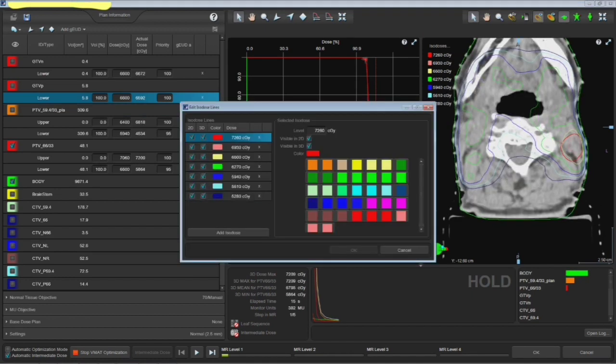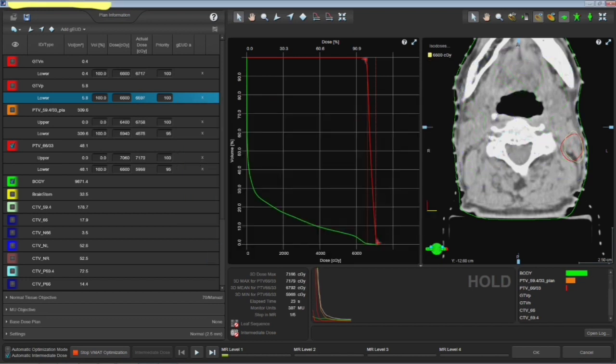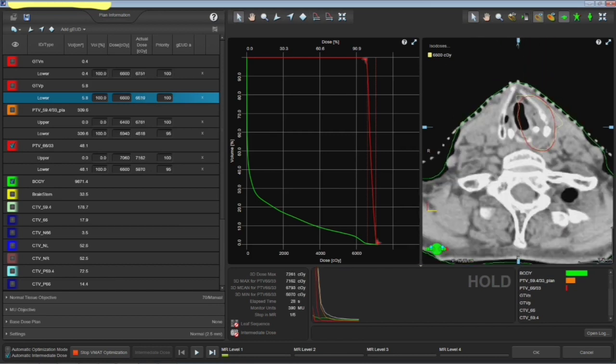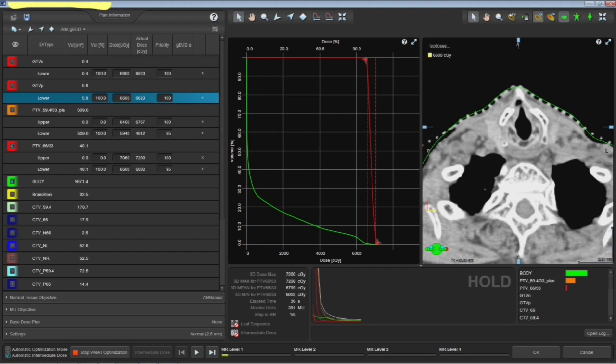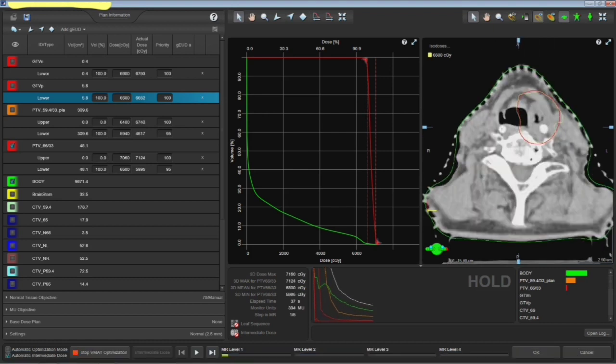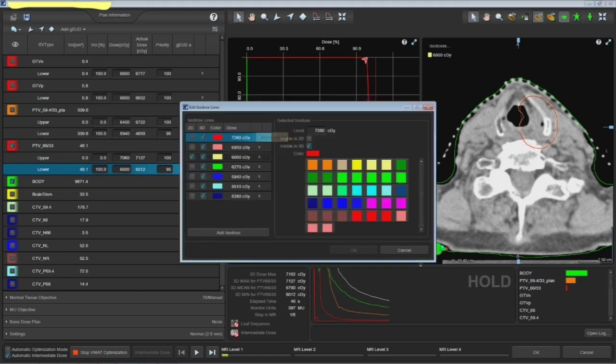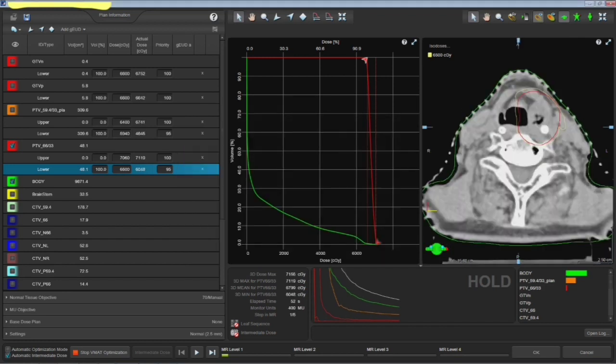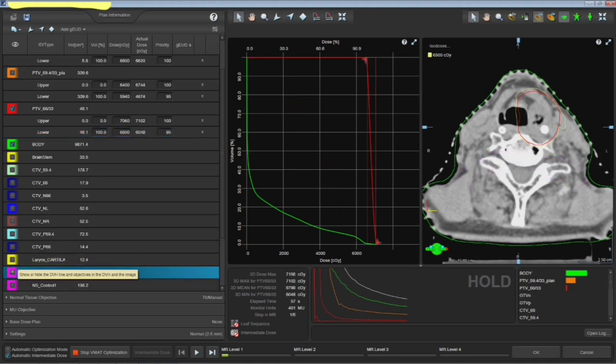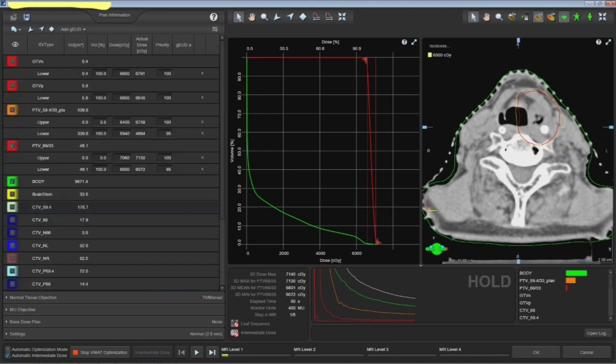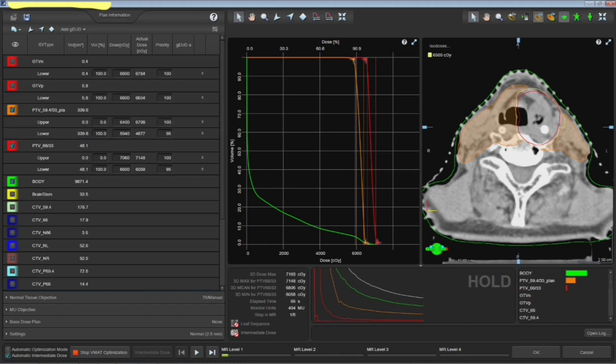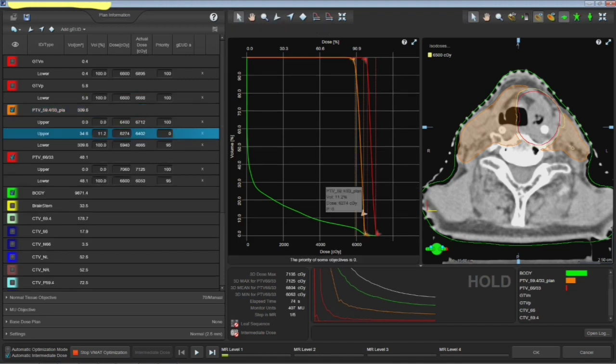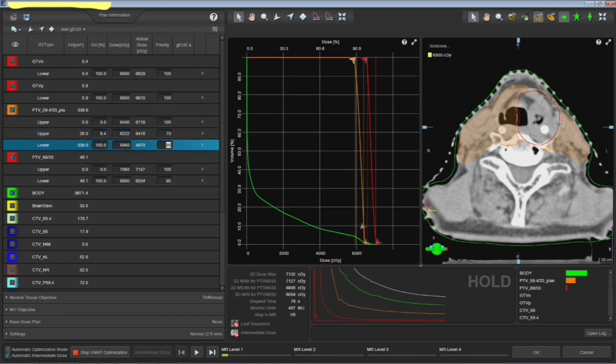So now the optimization is started. We'll talk a lot about this actually, intermediate dose verification. We need to talk about that as well. What is that? That's a GTV. Look at the main target. So by giving that constraint, what we actually do is that restricting the primary GTV dose going to the nodes.